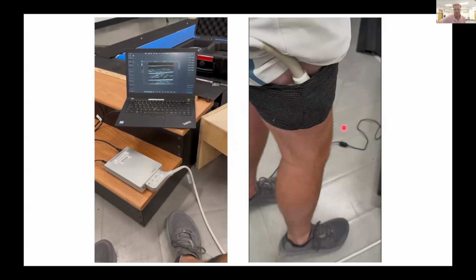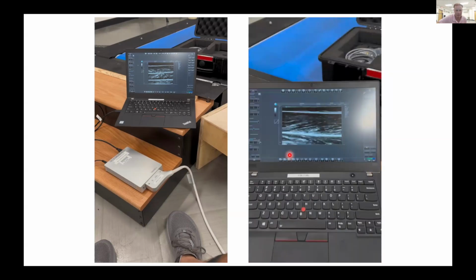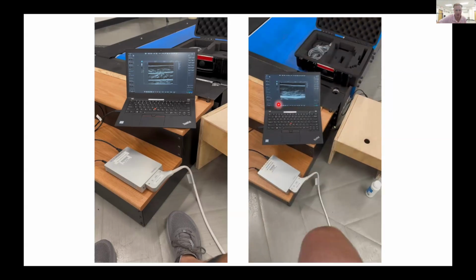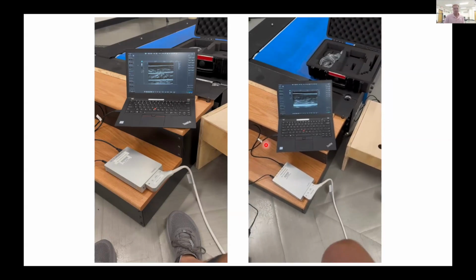And we also have the same thing over my vastus lateralis. Again, really nice connective tissue in there. You can see it from origin all the way to insertion, changing in length with knee extensions and flexions.